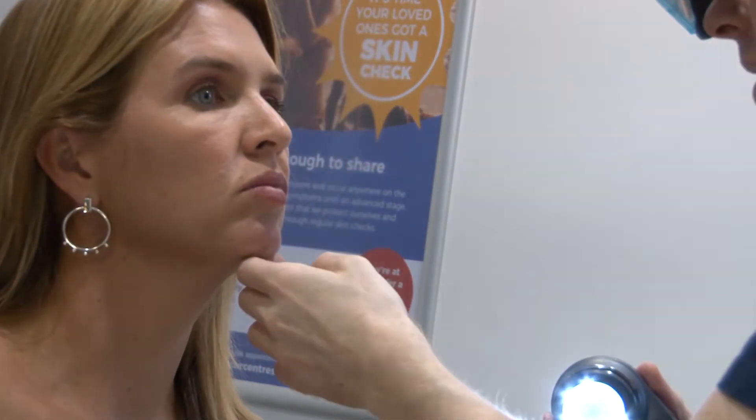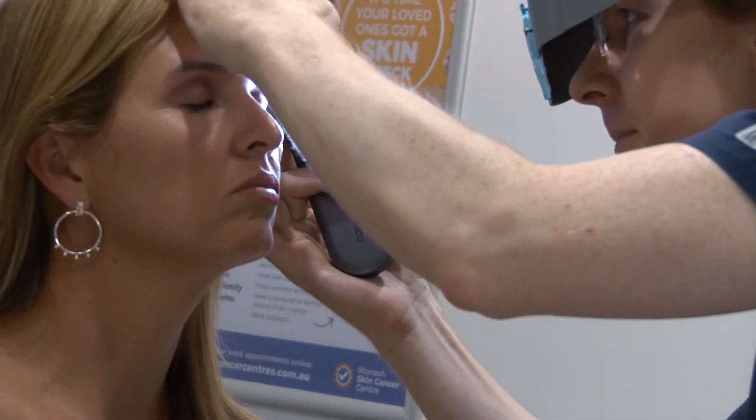I wear two and a half times visor magnification, so I can only see about a hand's breadth of actual skin at any one time. But I feel that without magnification I might miss some early subtle carcinomas or early superficial BCCs. So I wear the visors and I check the top third, then the middle third, then the lower third of the face. I explain to the patients that there's a reason I'm touching your temples and feeling your forehead and running my hand over your nose — because sometimes you feel these precancerous things, like solar keratoses, before you actually see them.